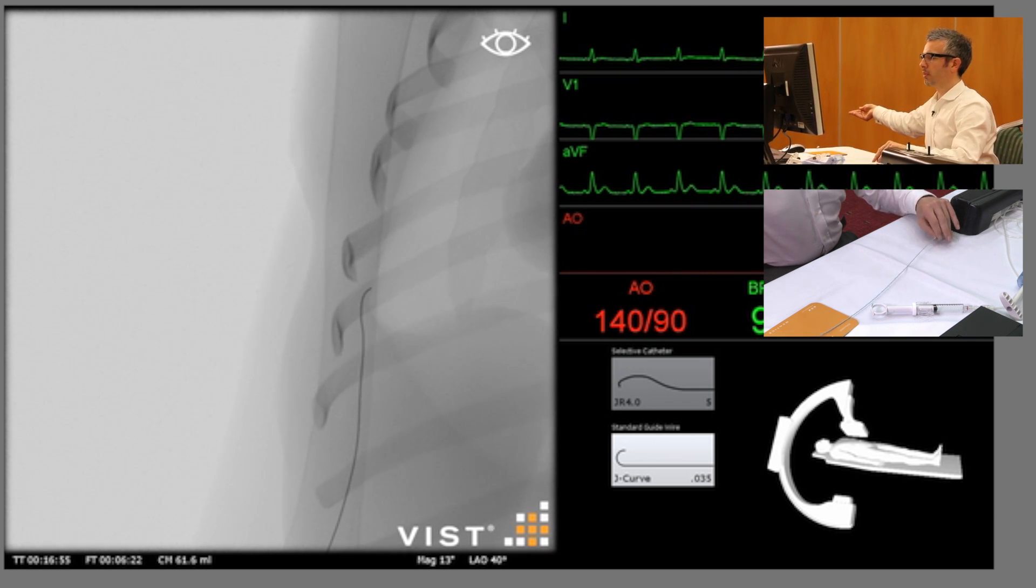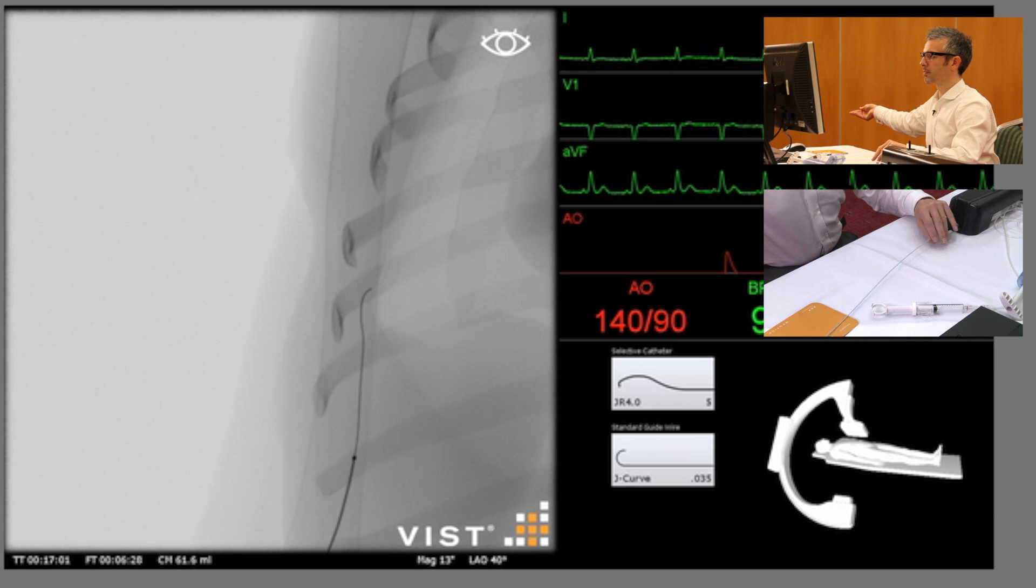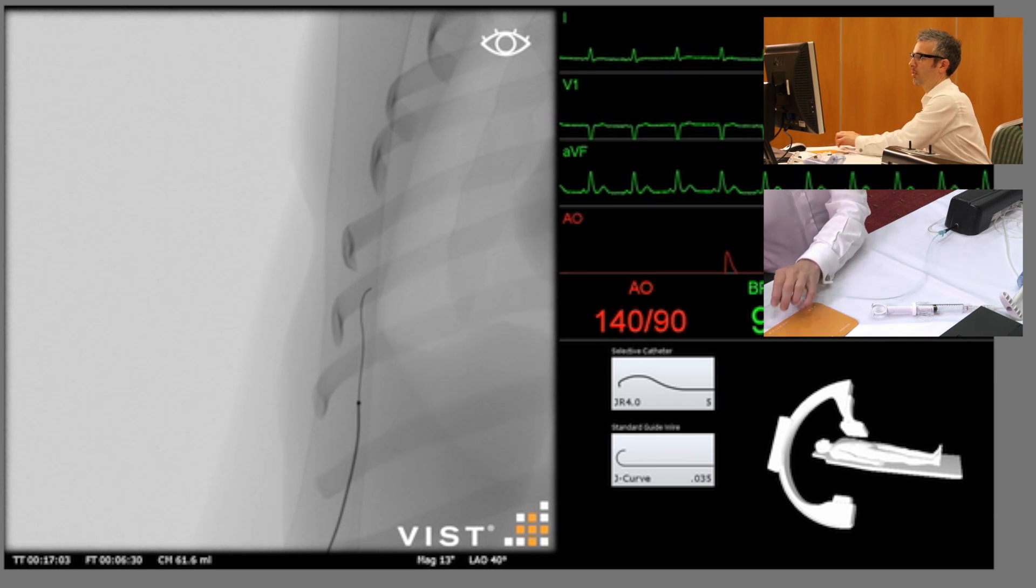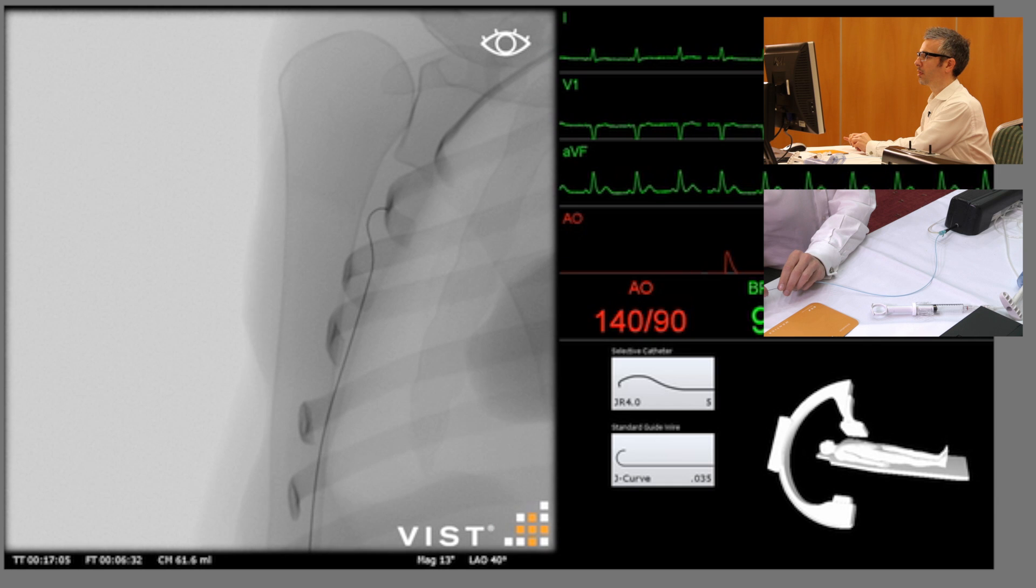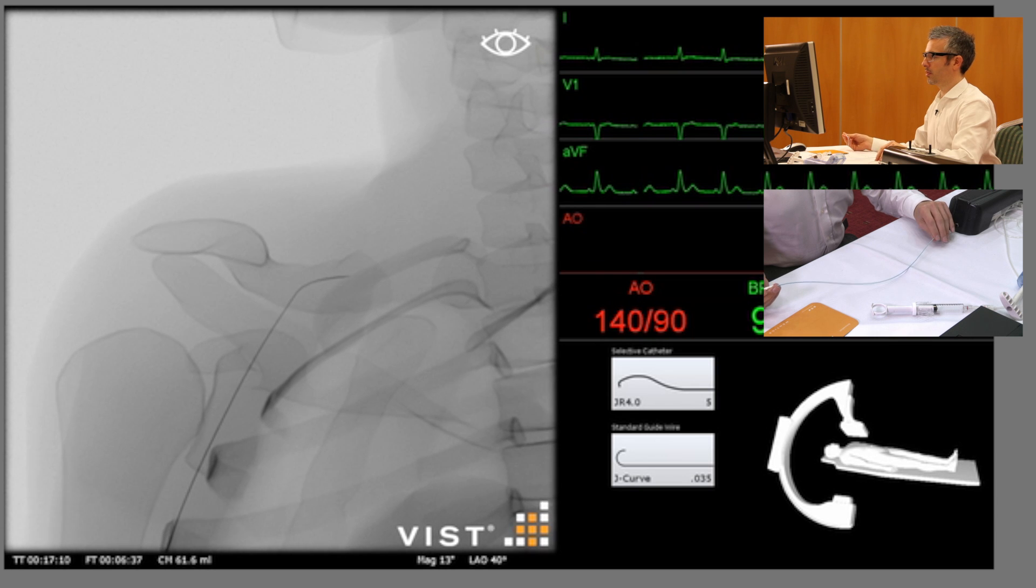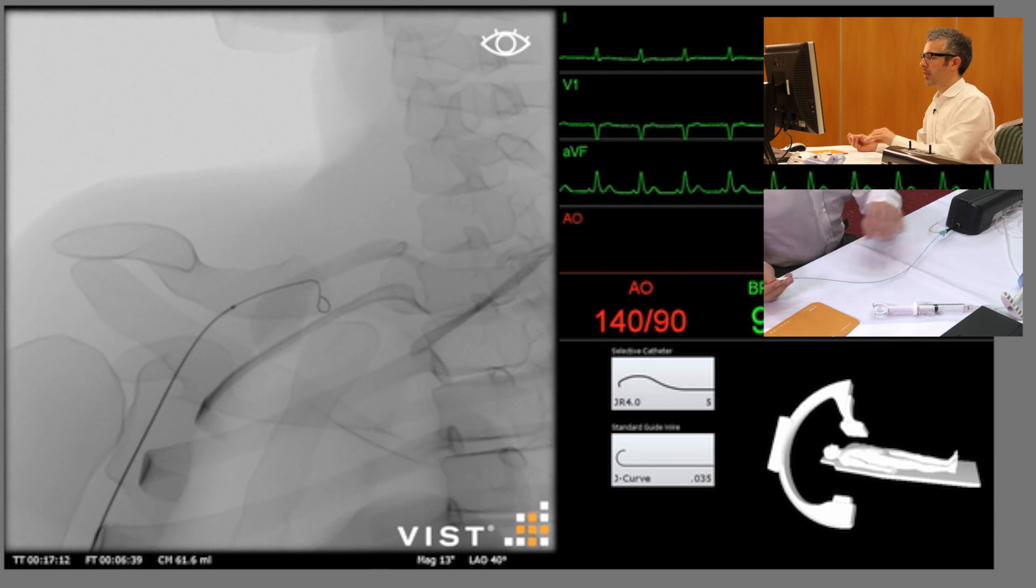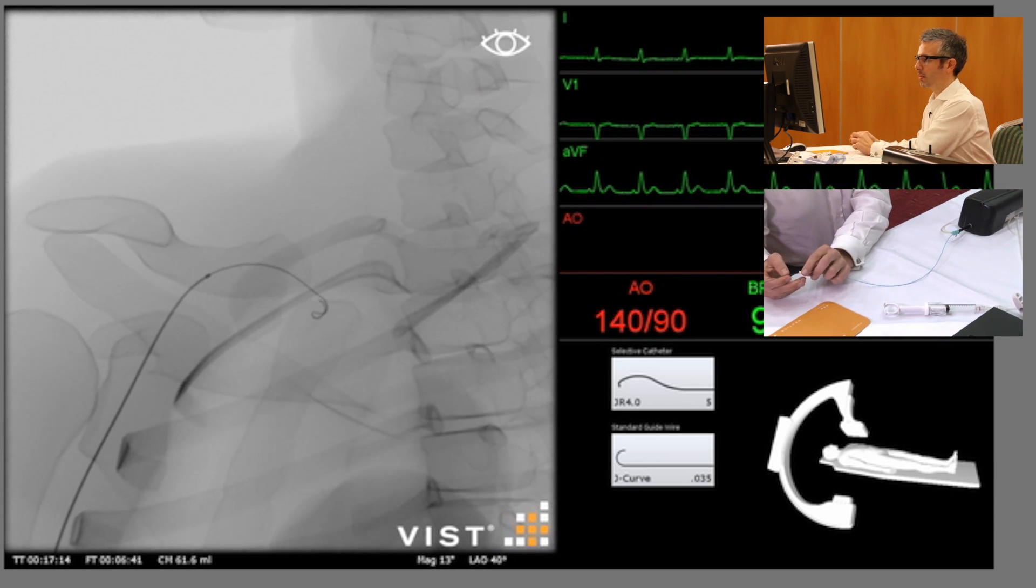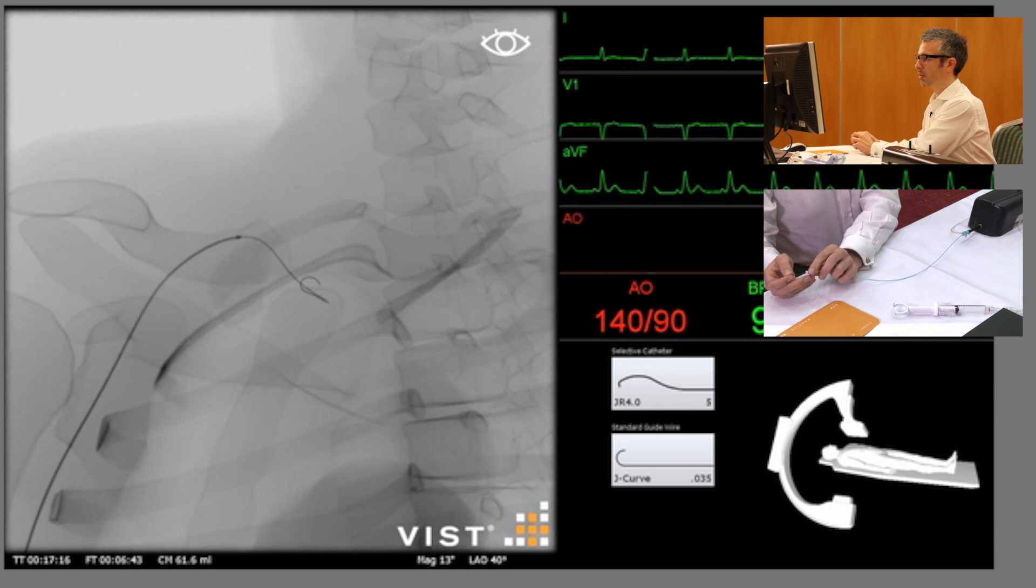The view here looks a little strange because we've got the camera preset into an LAO view but that will help us as we come round into the subclavian artery, past the head and neck vessels, because this will allow us to see whether we're going into the ascending or the descending aorta.